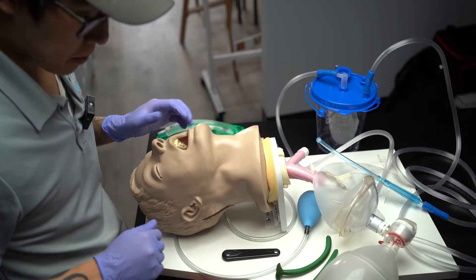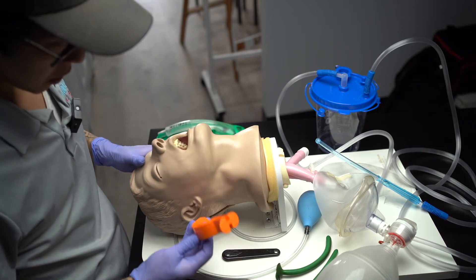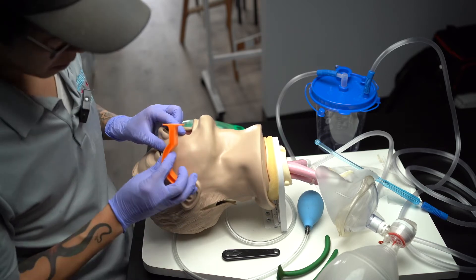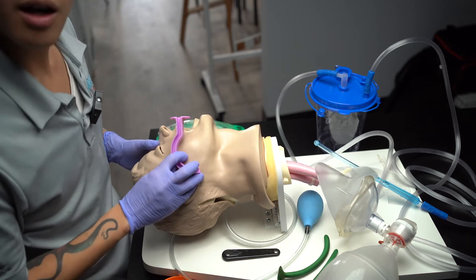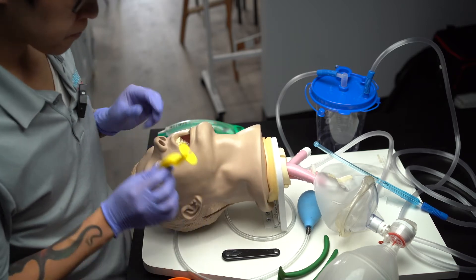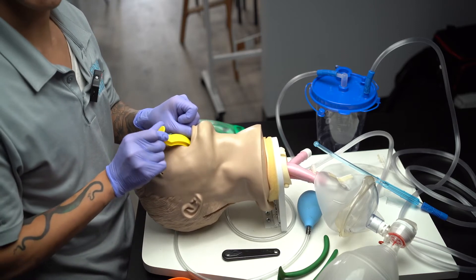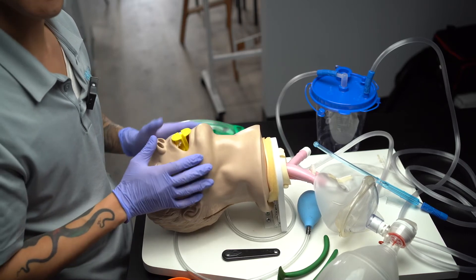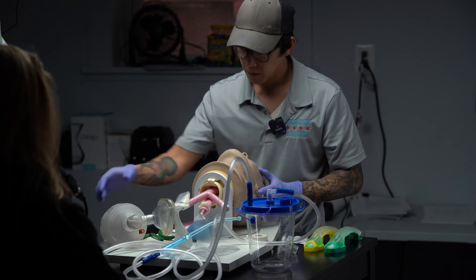I'm going to need to utilize my BVM. Whenever we utilize a BVM, we want an airway adjunct, whether that's an NPA or OPA. The first line is going to be the OPA. Let's see if the patient has a gag reflex. Let's see if the orange OPA lines up — measuring from the earlobe to the side of the mouth. The orange OPA is a little too big. The pink is still a little too big. The yellow seems to be just right. I'm going to use the scissor technique to insert the OPA upside down about halfway, then rotate 180 degrees. Does the patient accept the OPA? Yes, there's no gag reflex — your patient accepts the adjunct.